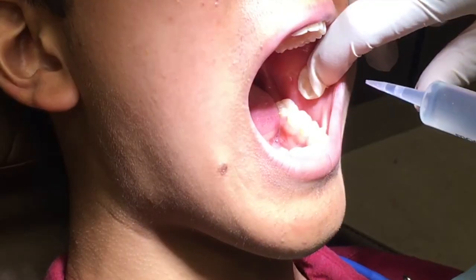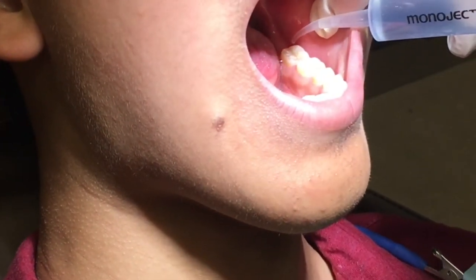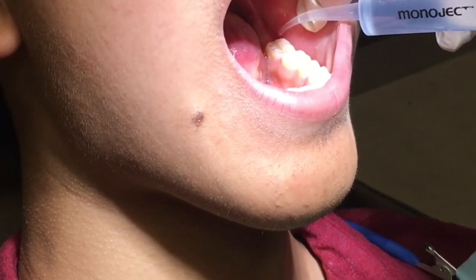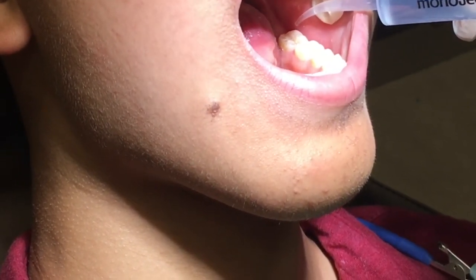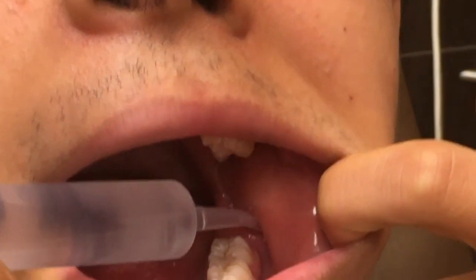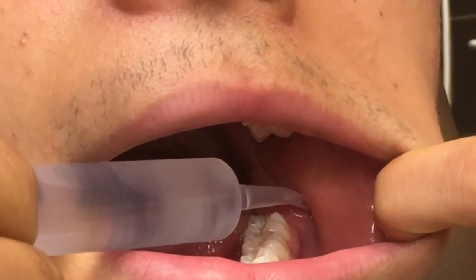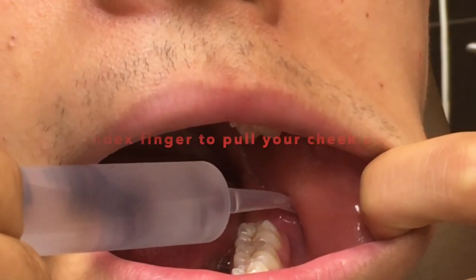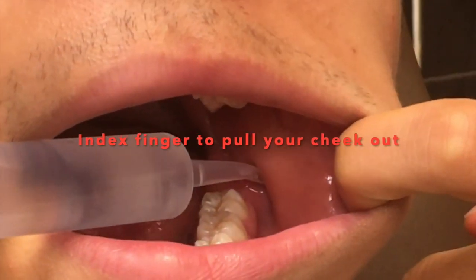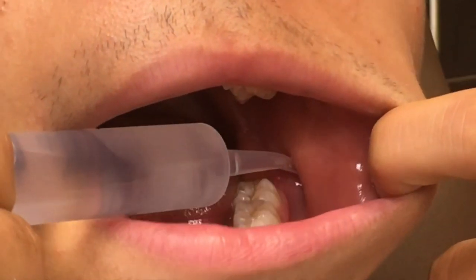What you can do is take this gentle curve and aim it behind the second molar region, and just gently flush water until some of the debris that's back there is removed. Jay has the syringe pointed in the third molar area behind the second molar. Many times when the patient puts their finger in their mouth like this, they can pull their cheek out enough where they can actually see the opening. They're going to need to be looking in a mirror for them to be able to see that.